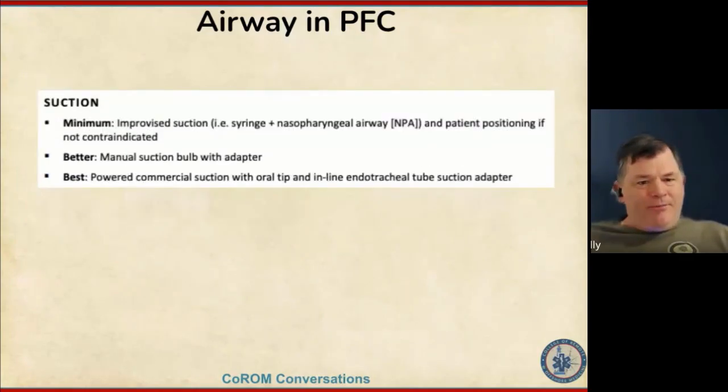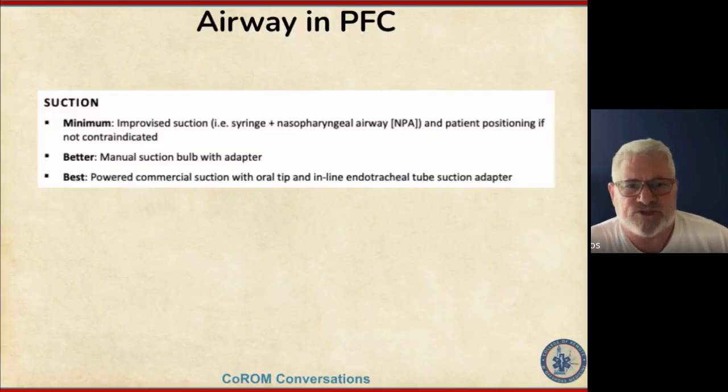So moving on. Suction. So what are we looking at? Just some way to remove secretions from the mouth, whether that's an improvised suction with a syringe and a tube, whatever it is. Those things are all horrible. Some people have had good luck with that manual suction bulb, the adapter. Part of the reason why those things are not as effective as they could or should be is because we don't practice with them. You just take a cup and put some secretions in it and try whatever improvised suction device that you can come up with, and see how well that functions. Like, where does it stick? How do you pull the plunger back? You can't do it with one hand unless it's got one of those little thumb loops, and then your hand has to be strong enough to pull it against whatever you're trying to suck through the tube.